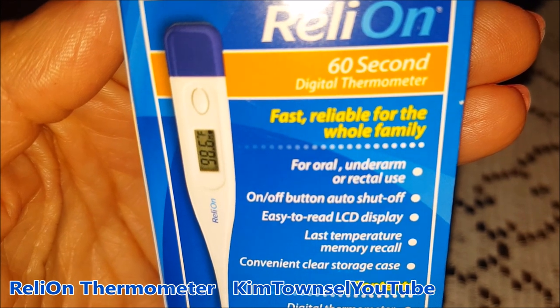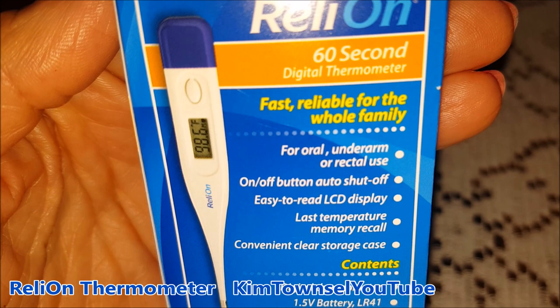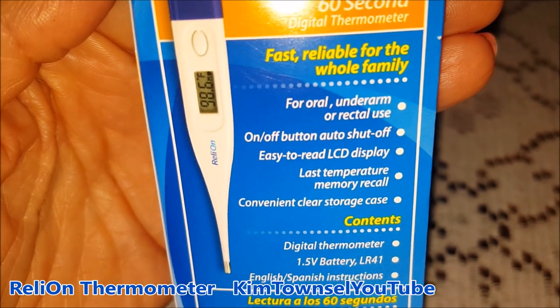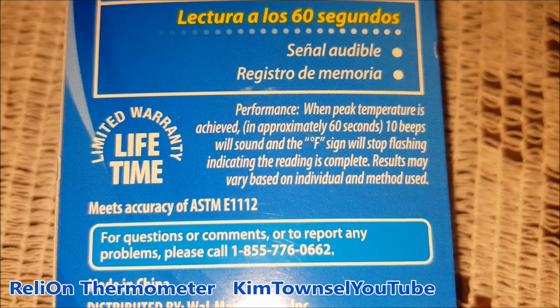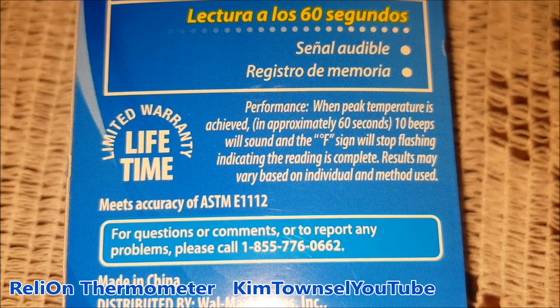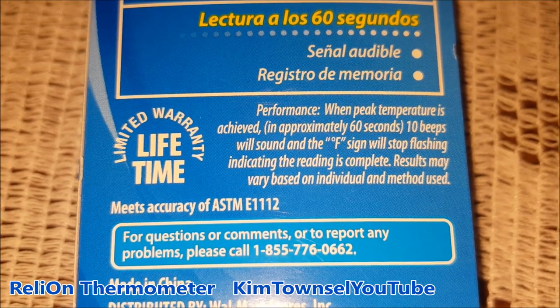Not going there. It has an on/off button, auto shutoff, and an easy-to-read LCD display. Memory recall and a storage case. It's digital and uses a battery that's supposed to be included. When the peak temperature is achieved — which takes about 60 seconds — it's going to have 10 beeps and the F sign will stop flashing, indicating the reading is complete.